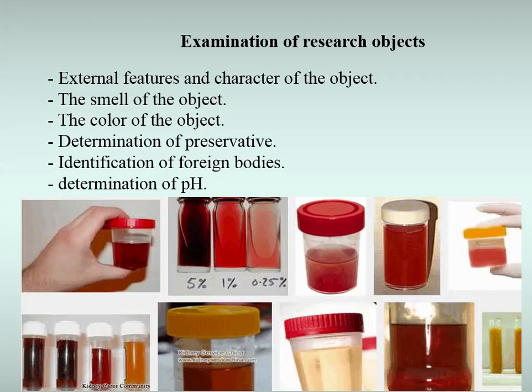Formalin also causes breakdown of a number of other toxins, for example ammonia and hydrogen cyanide, making it impossible to find and prove them. Therefore, before starting chemical toxicological analyses, it is necessary to know whether the research object contains preservatives and, if so, which one. If the forensic chemical laboratory receives biological material preserved with formalin, phenol, or other substances, the chemist-expert must draw up an act on violation of the rules of sending objects for chemical toxicological analyses and send it to the forensic investigation department.